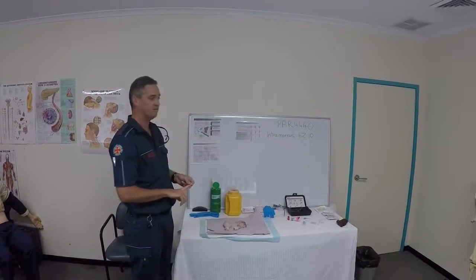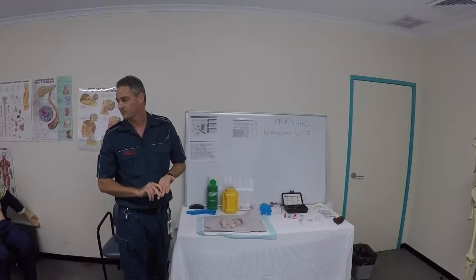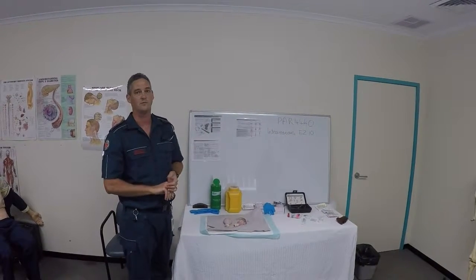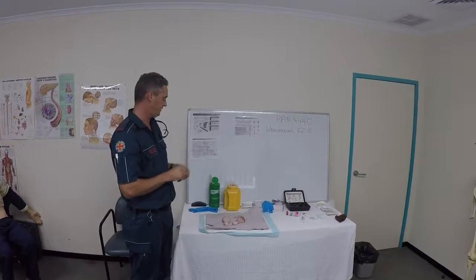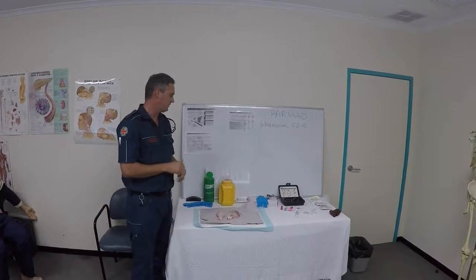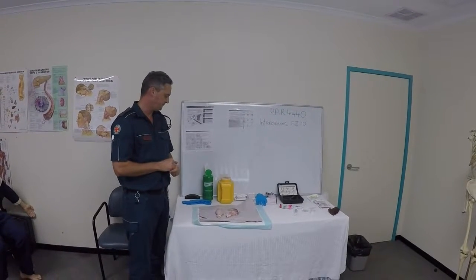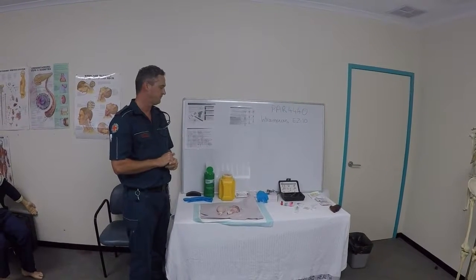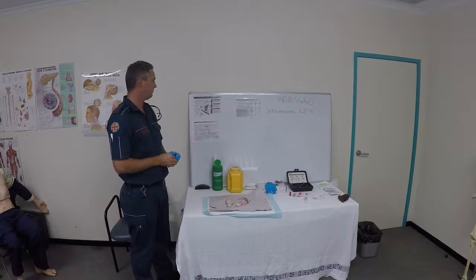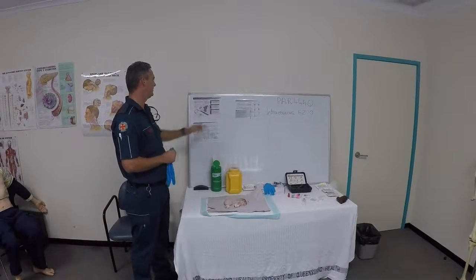I'll cover the indications according to the QAS landmark sites. I'll also give you a practical demonstration of all our landmark sites that we use, finding those, and then finally I'll give a practical demonstration of Easy IO insertion into a chicken leg to aspirate blood, bone marrow and show the technique.